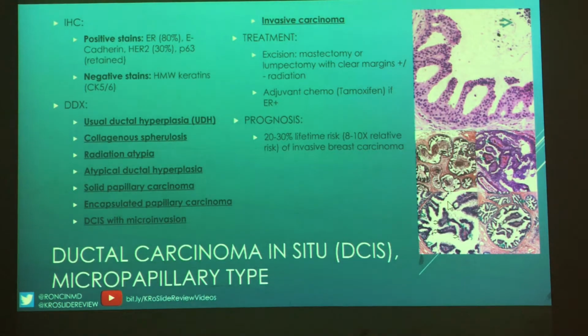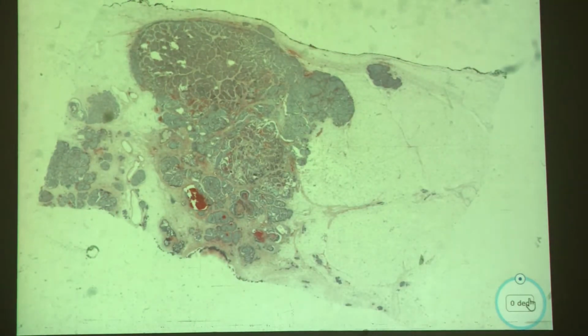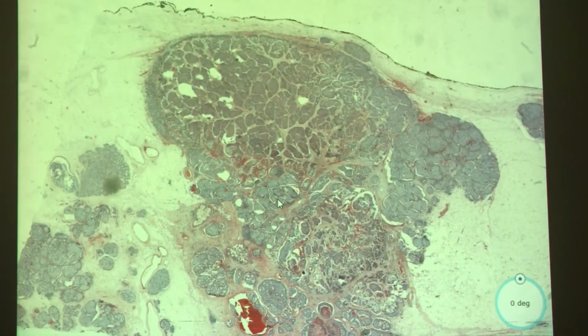Okay, and all this again is the same as the DCIS. So again, this is a nice lesion here of some sort.